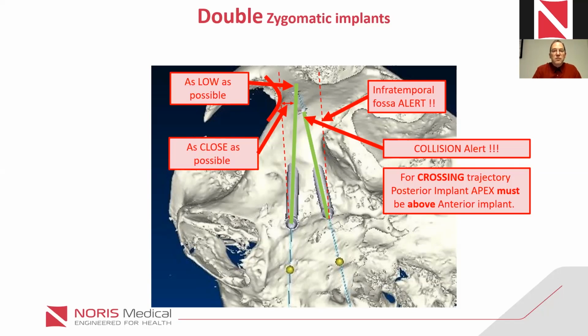And we also have to remember that a Zygoma implant does not work for itself. There is a construction. We have Zygoma implants, we might have other implants involved, we might have pterygoids, but once we have a construction and we put the rigid bar on the construction, it's like building a bridge. I mean a bridge over a river, not a bridge in our mouth. If you take just a piece of metal, when you put them all together in a construction, they give you the strength of a construction.